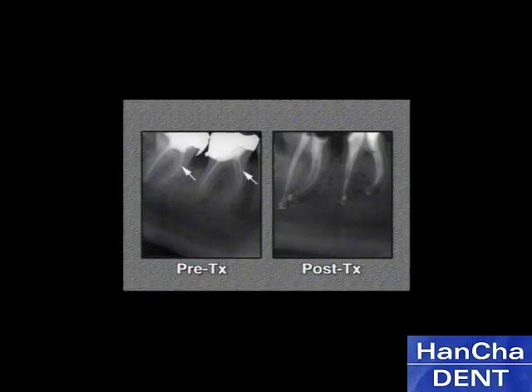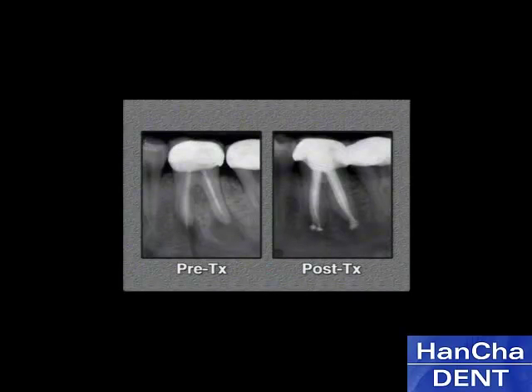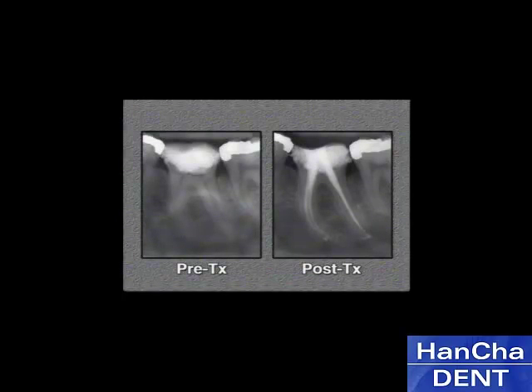Canal projection is particularly useful in management of the curved canal, the canal obstructed by separated instruments or calcifications, the perforated furcation or the perforated root, the retreatment case, whether simple or complex, as well as in the isolation of teeth with severe coronal breakdown.